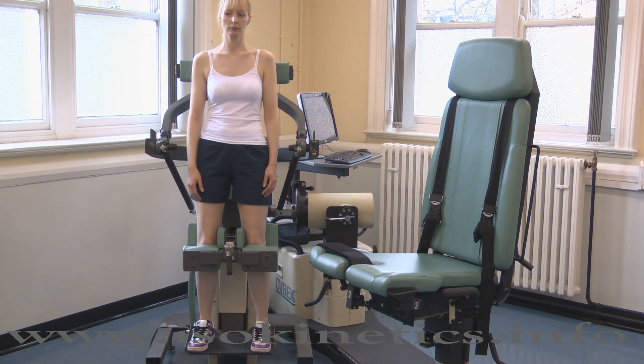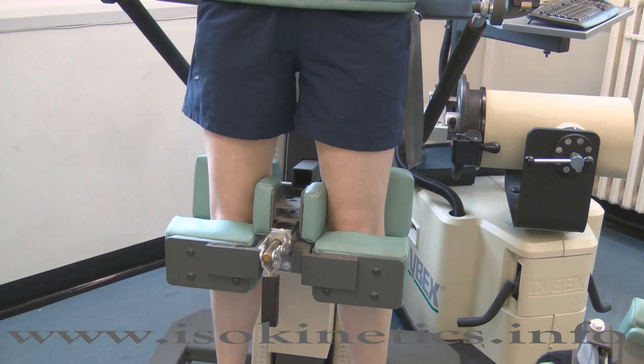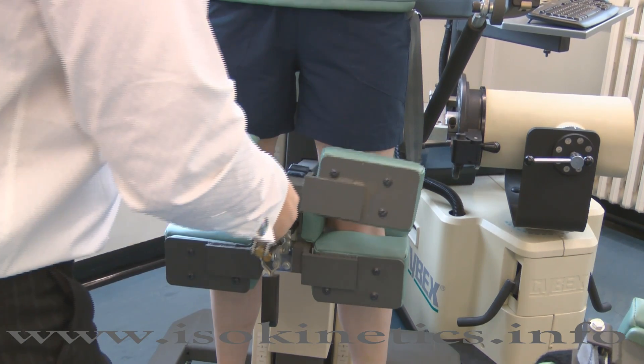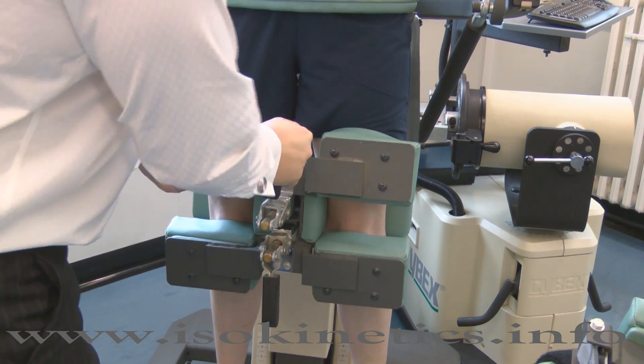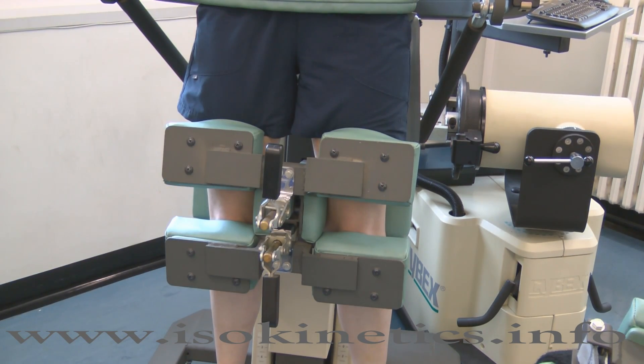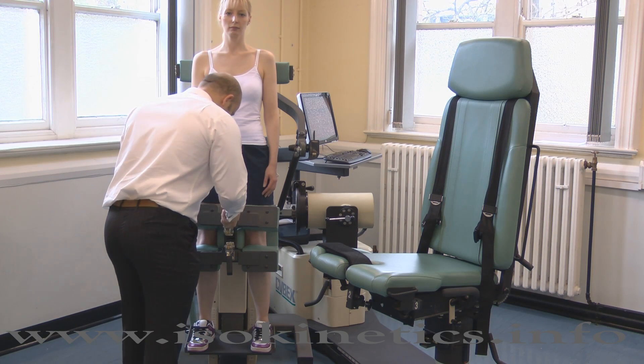Place the thigh pad into the receiving tube on the thigh stabilizer with the handle facing upwards. Note well: the thigh pad should hit the thighs above the patella. Ensure the thigh pad has firm pressure on the thighs, but it should not impede blood flow. Press the lever upwards to secure.